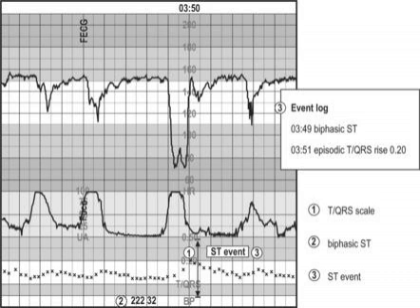As you can imagine, this is much more complicated than trying to measure the pulse ox in an adult. As I mentioned, traditional pulse ox machines shine light through a portion of the body and measure how much light makes it through by using a light receptor on the other side. In a fetus, we don't have that kind of access, and so new technology was needed. Researchers found that instead of measuring the transmitted light, we could instead measure the reflected light. And early studies demonstrated that the probe would need to be attached to non-hair-bearing and non-edematous portions of the head, and so the fetal cheek or temple became the accepted placement for these probes.